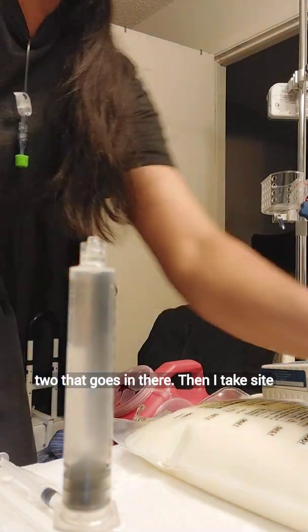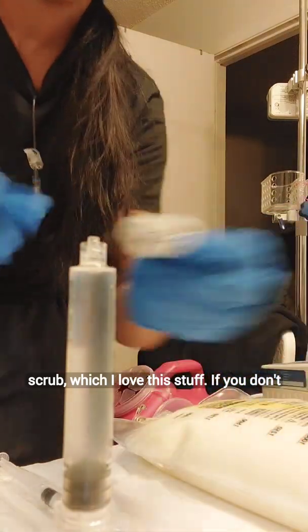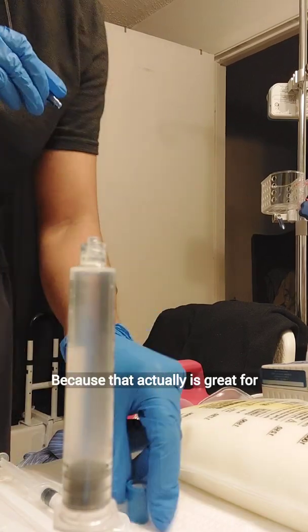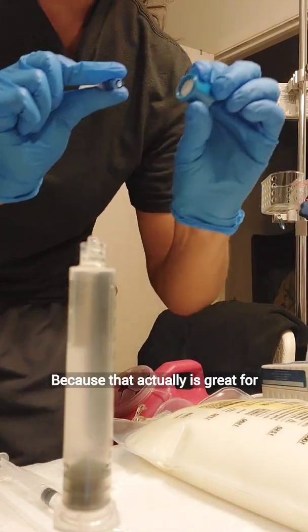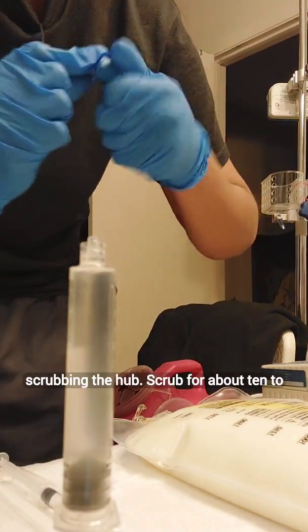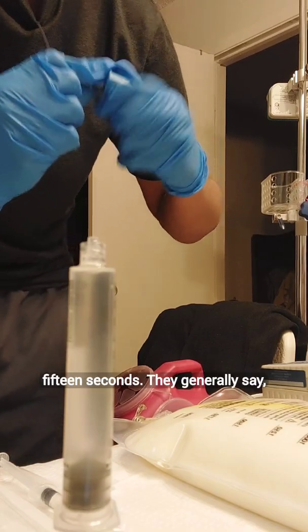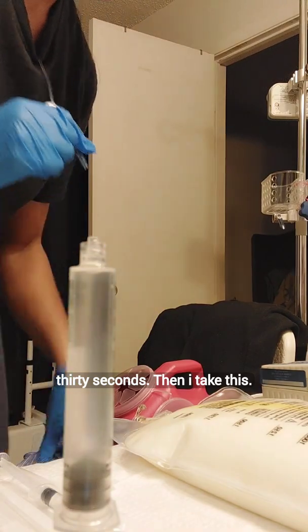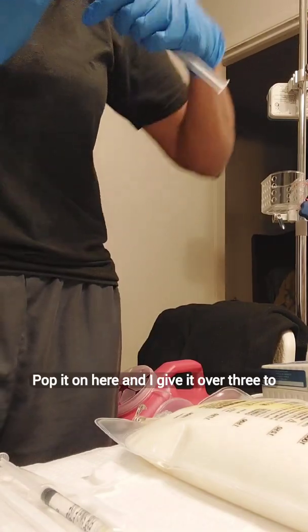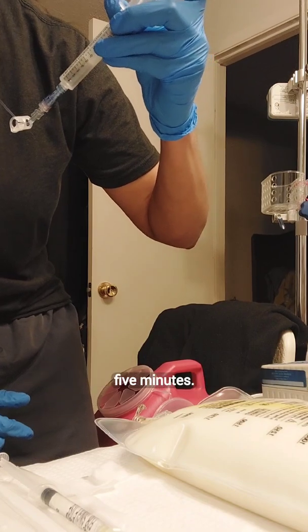That goes in there. Then I take SiteScrub, which I love — if you don't have it, be sure to ask your provider for it, because it's great for cleaning. So this is what's called scrubbing the hub. Scrub for about 10 to 15 seconds — they generally say 30 seconds. Then I take this, pop it on here, and give it over 3 to 5 minutes.